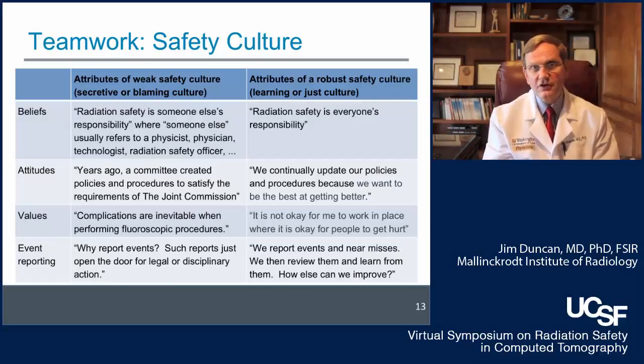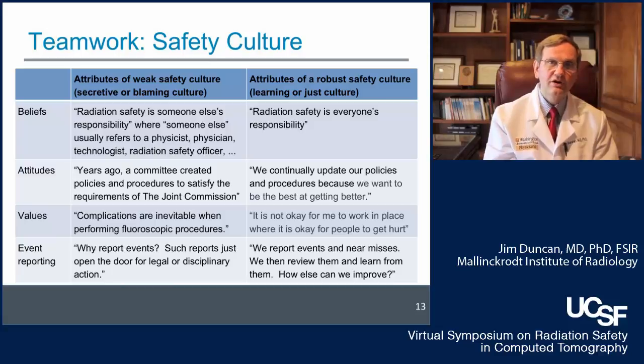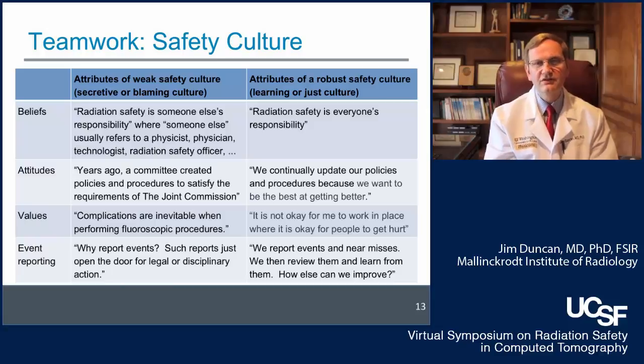Teamwork also depends on culture. Are you at the low end with a weak safety culture? Or hopefully you're at a robust safety culture? Well, you can look at what are the beliefs. If radiation safety is always somebody else's responsibility, you're at the weak side. If radiation safety is everyone's, the primary operator, the technologist, the nurse who's sedating the patient so that they can still follow my instructions and hold their breath when I need them to.